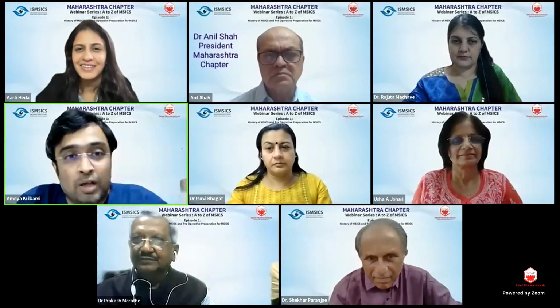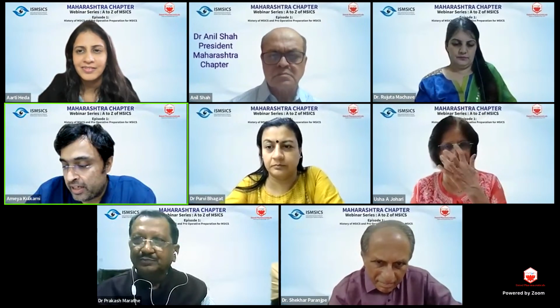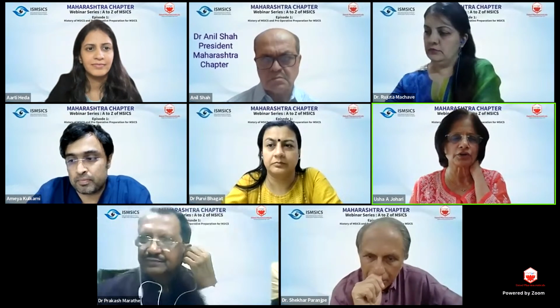Yeah. On YouTube, there is a question: kyphosis part was well covered, any tip to operate on a patient of kyphosis? It depends on the severity of the kyphosis, isn't it? If it's a very gross kyphosis, keeping a neck rest and raising or lowering the chin, and the surgeon has to adjust their sitting depending on the side of the kyphosis.